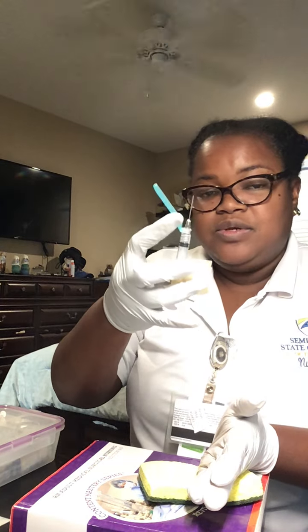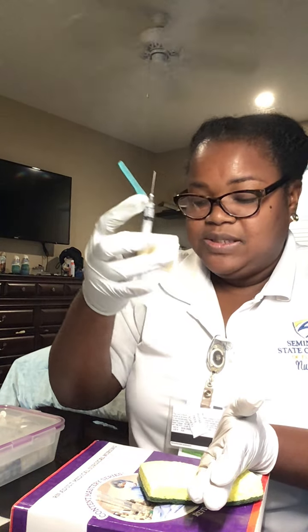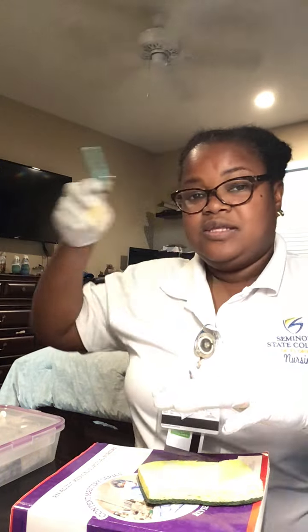The safety I'm not going to do because I'm running out of material. Release. I put a gauze on the top, no massage, and this is going into my needle container disposal.